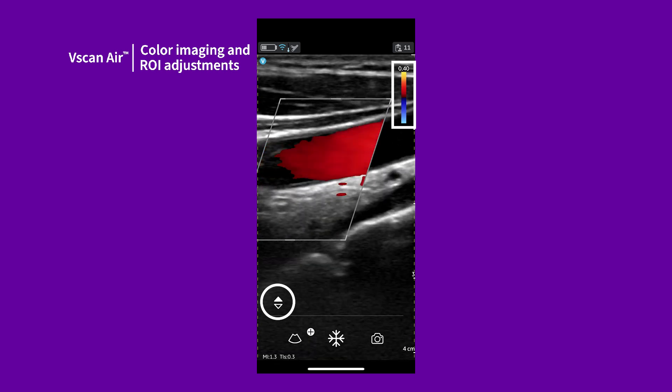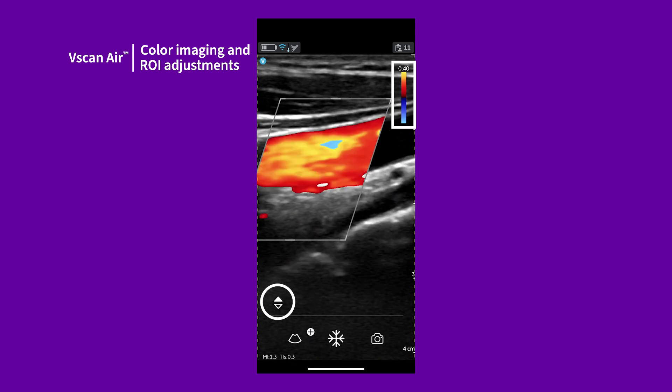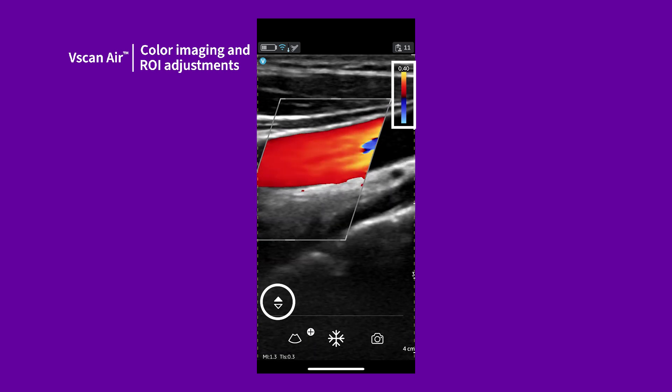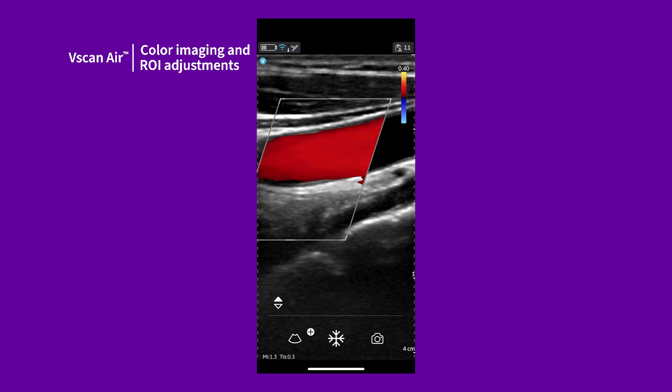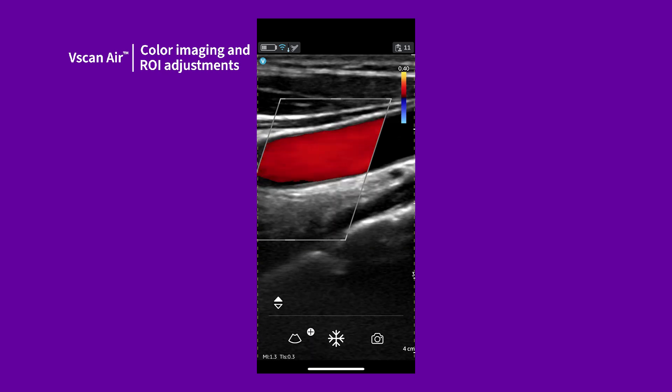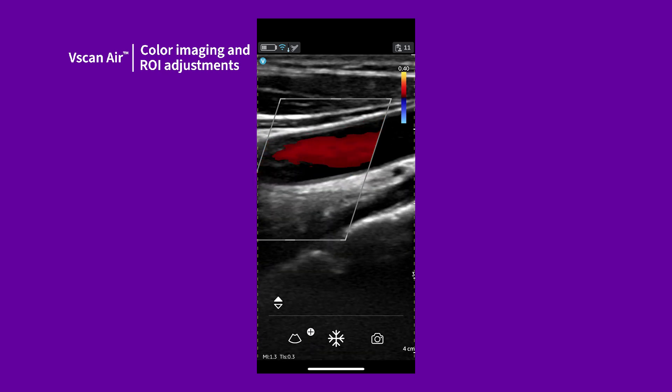This is useful for imaging venous flow in the extremities or renal flow. You can toggle between high and low velocity scales within a preset.